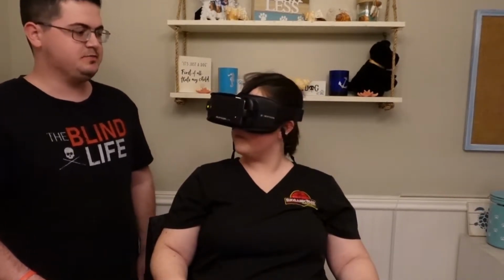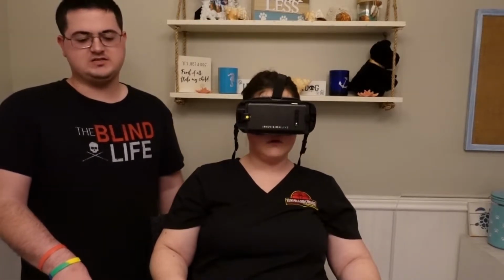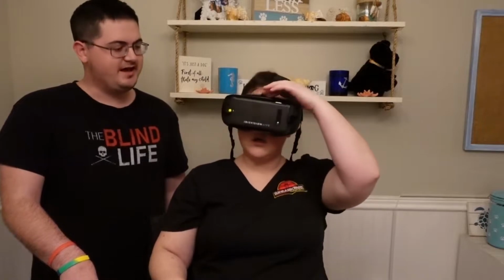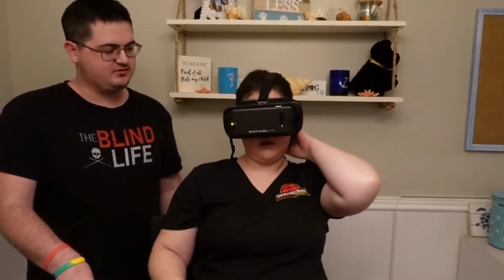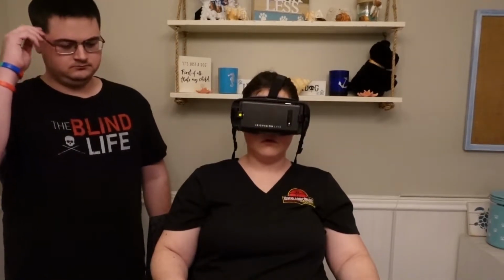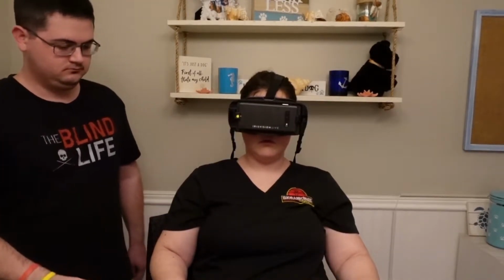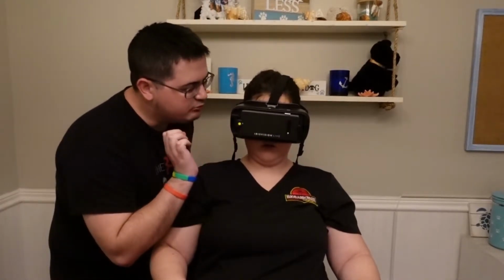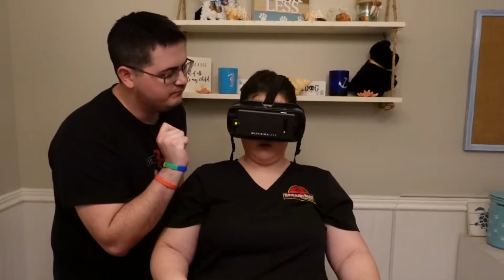Scene mode is supposed to enhance your overall experience with the things around you and what you're interacting with. Makes everything brighter. Yeah, exactly. It enhances the contrast of colors. So there is scene mode with bubble. Go ahead and press the button once to change the mode. Scene with bubble.